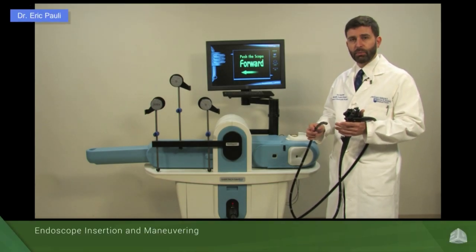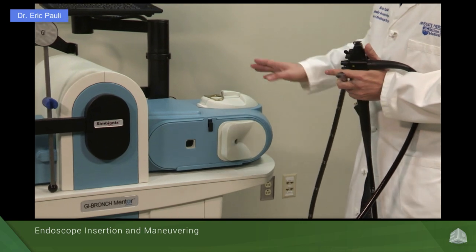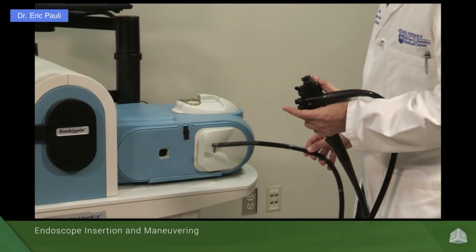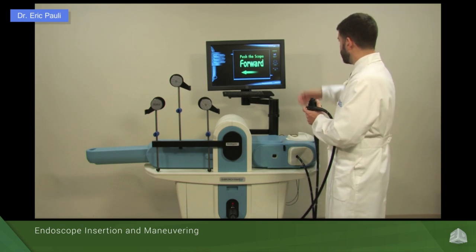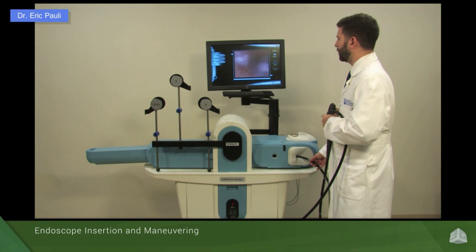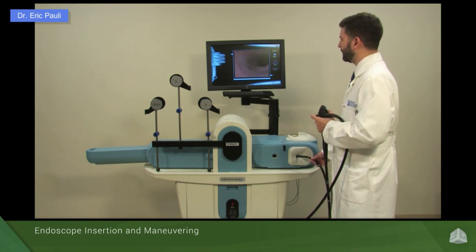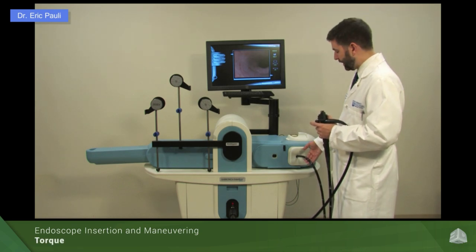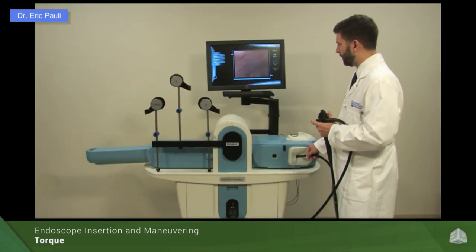Now we're going to focus on some of the basic scope maneuvers in terms of insertion using the left-right and up-down wheels, and work on torque. We'll use our simulator here. We want to hold the insertion tube with our right hand to insert the scope. We'll keep it in a neutral position going in. For the most part, we would want to stand facing our endoscope screen — that's a very ergonomic view looking directly across yourself at the video. The easiest maneuvers involve my right hand: by simply torquing clockwise and counterclockwise, we can see that our image moves clockwise and counterclockwise on the screen.